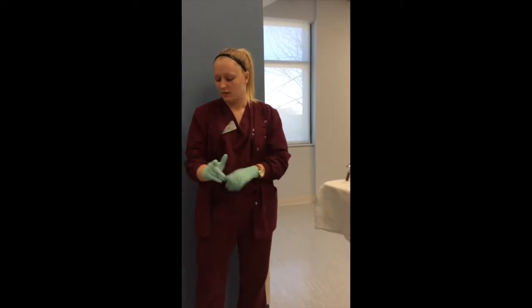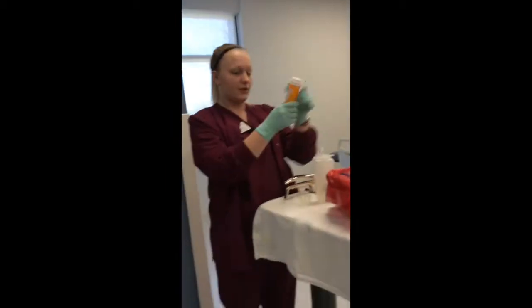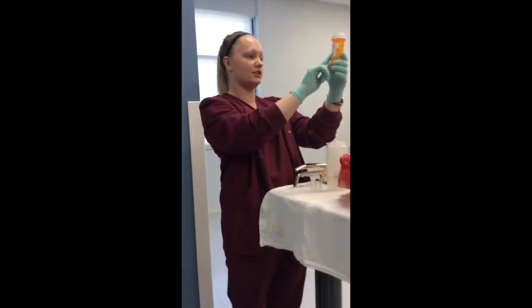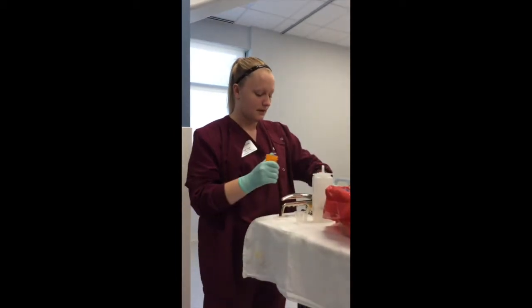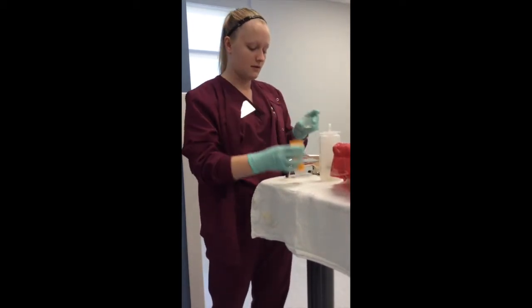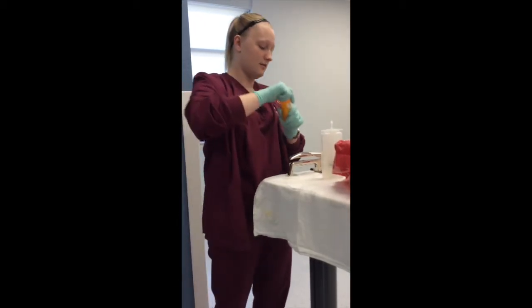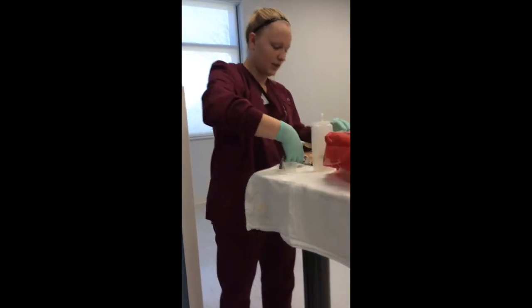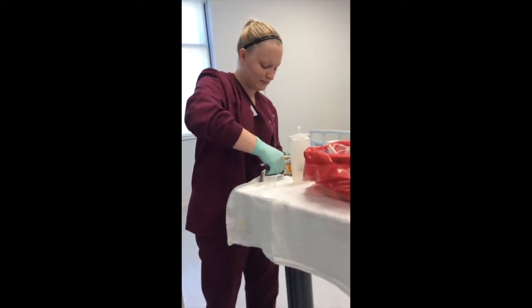But since this is a feeding tube, I'm going to prepare to give this medication like it's a feeding tube. So for the second time, I'm going to make sure with the MAR, yes, Lasix is the right patient, right medication, right route, right dose, all of those types of things. And I'm going to get one out. I'm going to set this aside. And I'm going to crush this. Checking for the last time, yes, it can be crushed. Okay.